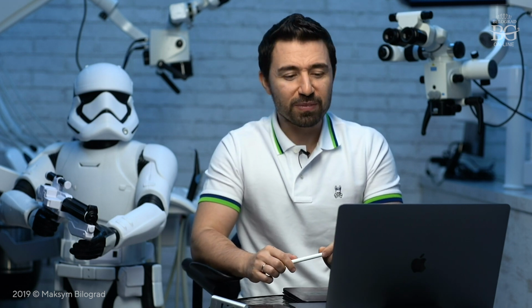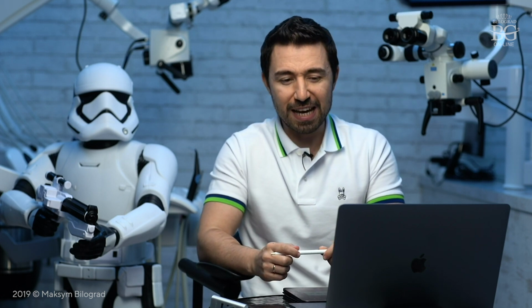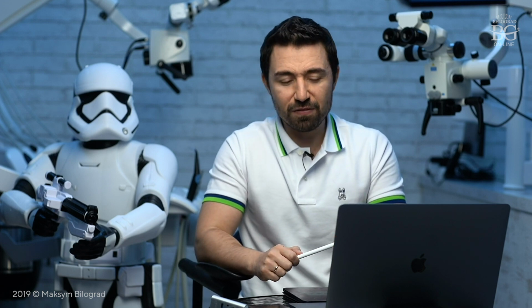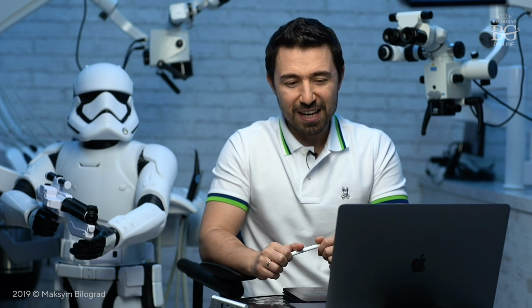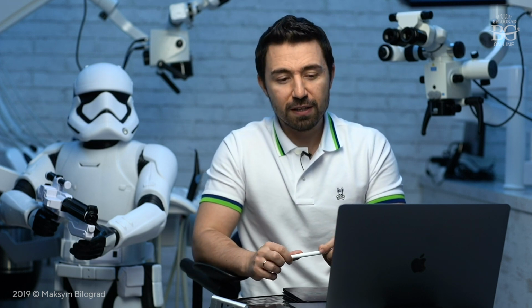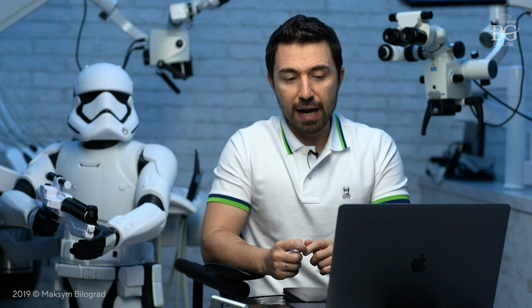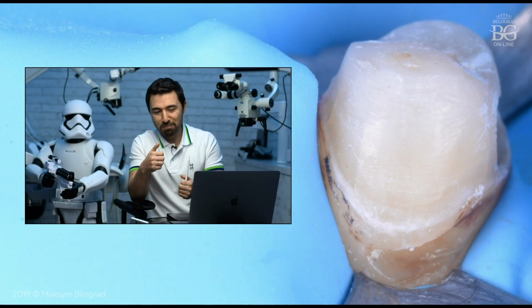This is episode number 6 of BG Dental Cases video tutorials, dedicated to clinical cases review. This time we will present to you 2 cases actually, because they are relatively the same. Very interesting cases, very lateral thinking cases, the cases that we call combined or hybrid restorations.